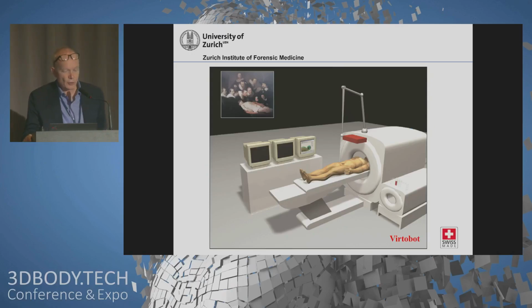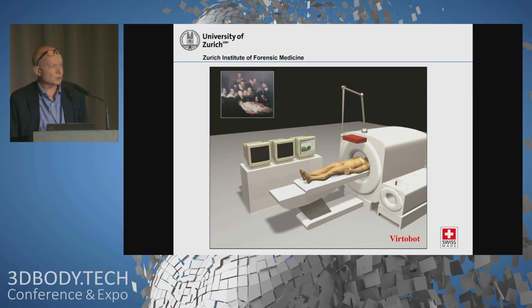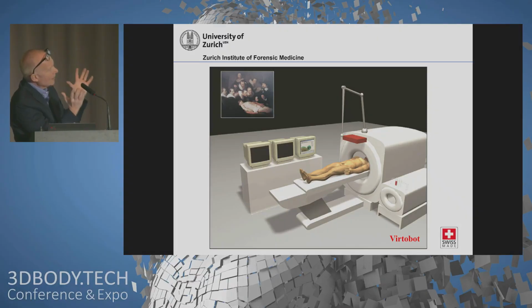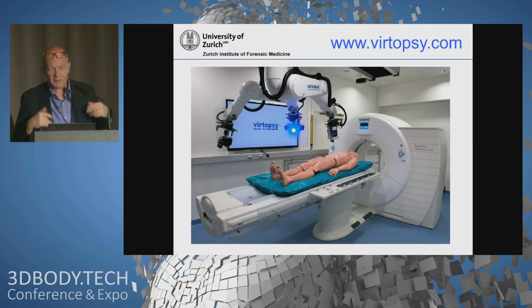Some years ago we had the idea that we wanted to replace the classical, gruesome, destroying autopsy approach in forensics using modern technology. So we had the idea of doing 3D scanning to get the surface of the body, real 3D data acquisition of the body of living and dead people, then scanning the body using CT scanning and a magnetic resonance scanner, and acquiring everything of a dead or living body in one stop, and then merging the data in the computer. And that was a vision 20 years or even more ago. So vision is always great if you work on that.